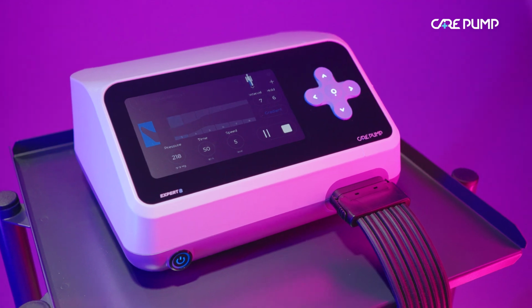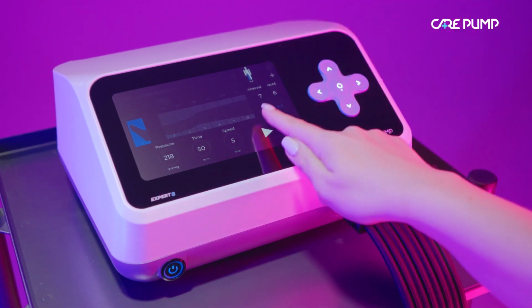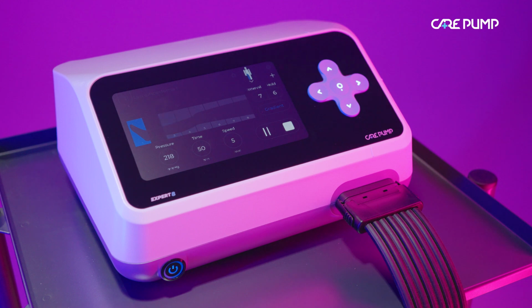To temporarily pause the treatment, press pause icon. And if you want to resume the treatment, press play icon. To end the treatment before the specified time has elapsed, press stop icon. It will deflate air from the chambers in the cuff and reset the treatment settings.